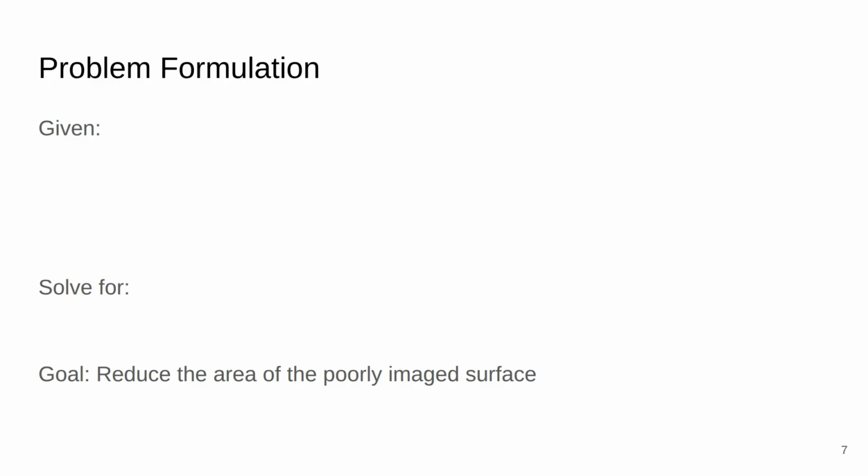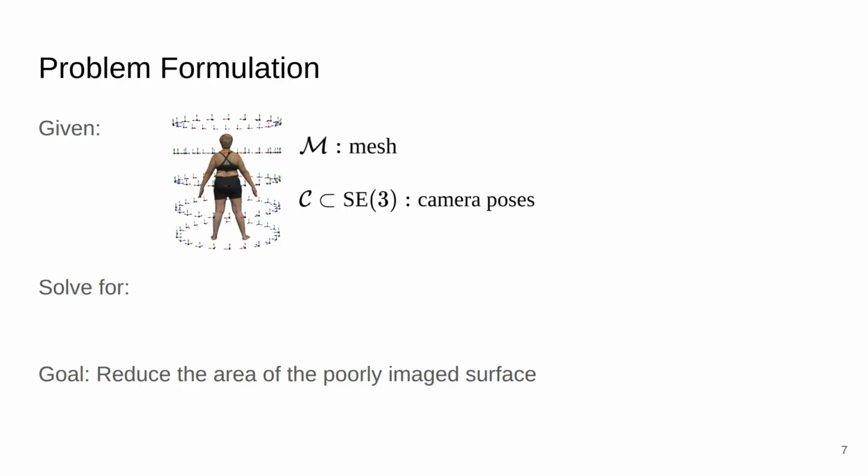Now, we understand the challenges of total body photography. Here, we would like to formulate the total body photography scan as a multi-view capture that's limited by camera's depth of field. The problem is formulated as follows. Given the 3D mesh of a patient, the camera poses in a scan, we would like to solve for a focus distance for each camera pose, so that we can reduce the area of the poorly imaged surface of the patient.